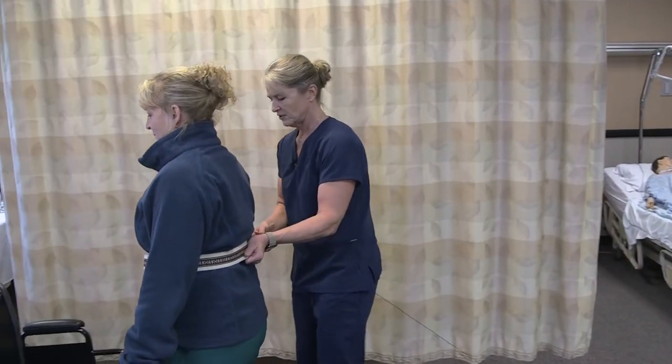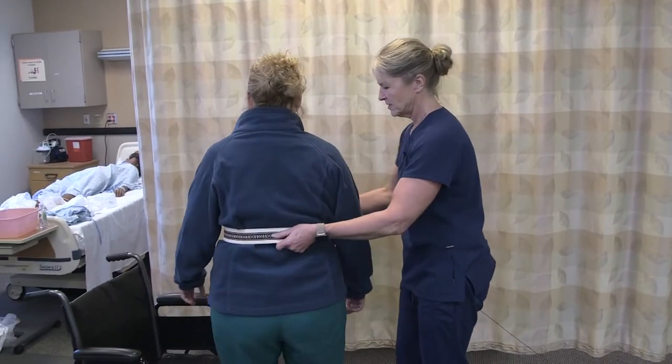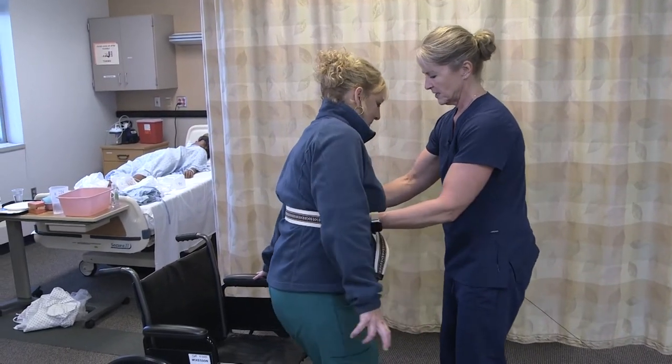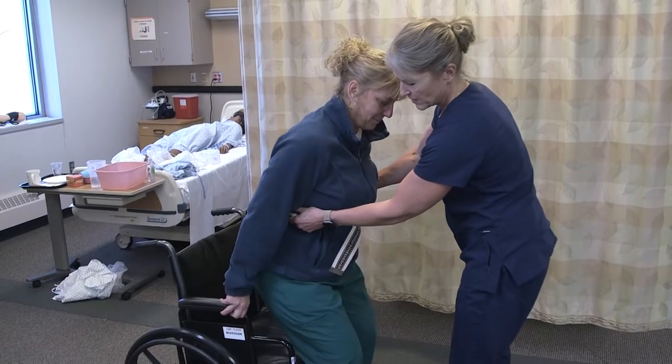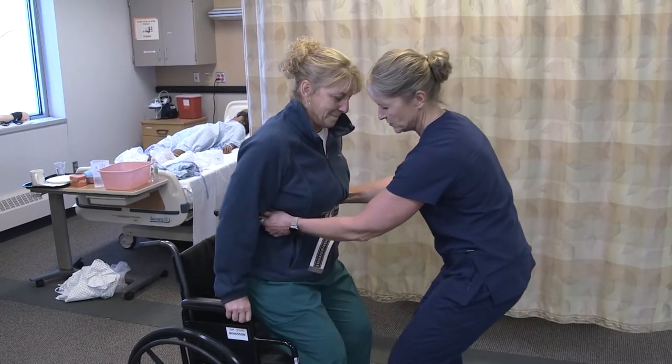Let's turn slowly right in front of your wheelchair. Make sure your knees are against the back of the chair — we have the brakes on. Put your hands back on the armrest and we'll go down. One, two, three.